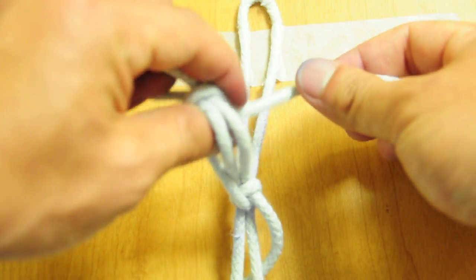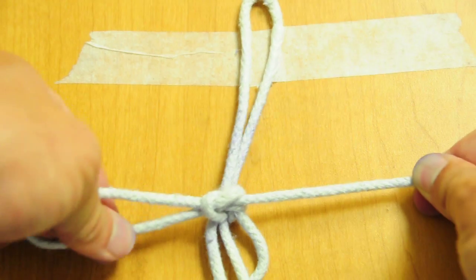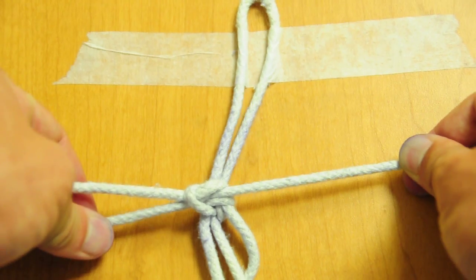We'll do an index finger throw. Come across, cinch down, one, two, one, two.